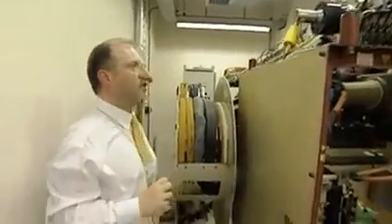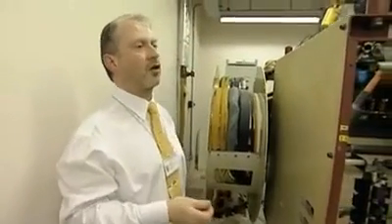So these are the components of the linear accelerator. It's a complex piece of electrical equipment.